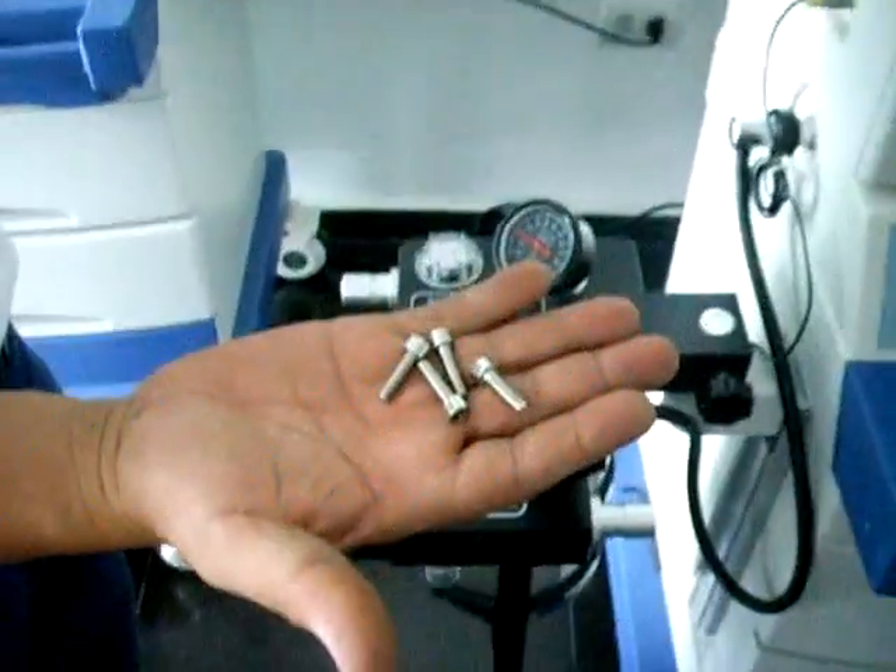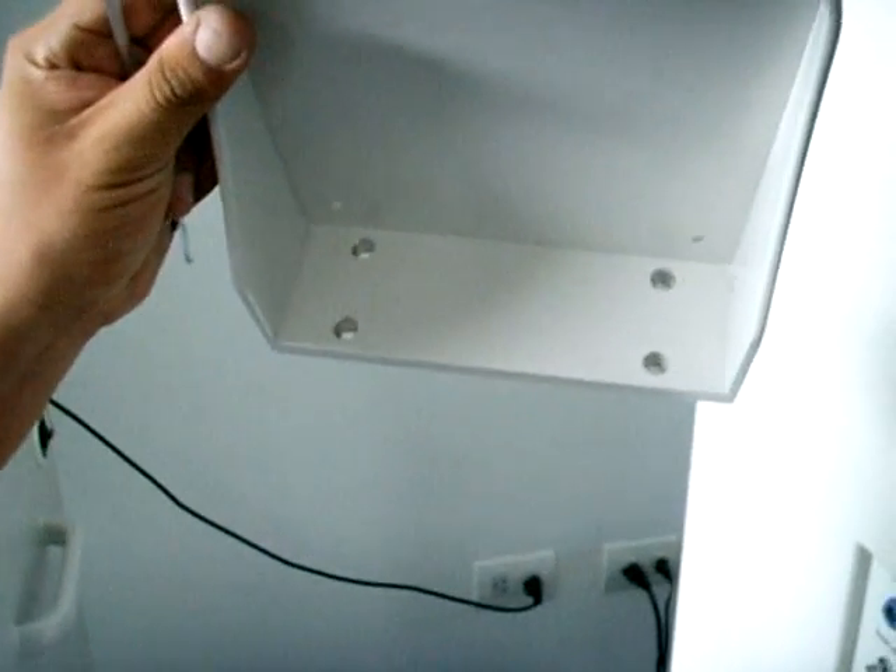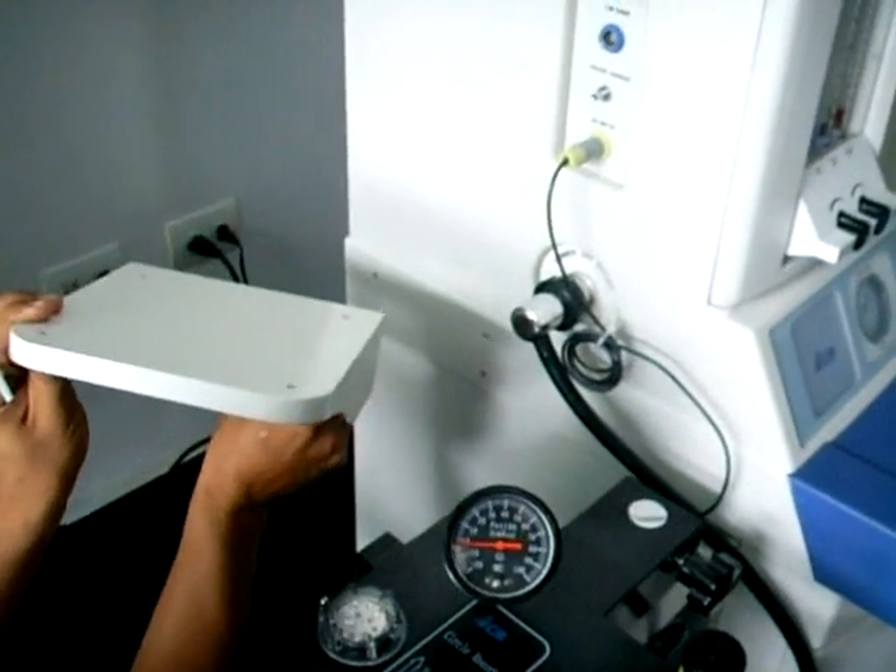Para la instalación de la base del fuelle identificamos los cuatro tornillos que serán adheridos a la máquina de anestesia y que serán colocados también en la base del fuelle adulto. Estos deben estar identificados en la parte izquierda de la máquina de anestesia, como se observa en el video.